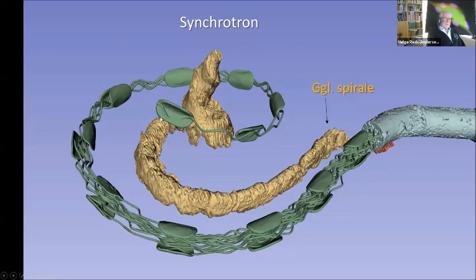Now here we have another cadaver inserted with an implant. We see the silicone coating here, and we can see very nicely the electrodes, and the spiral ganglion has been modeled. And here you see the problem with this enormously compressed region of the apical turn of the cochlea. Now the bone is removed in the computer program, in the Slicer 3D program, and you can see effectively this tissue without blurring from the bone.